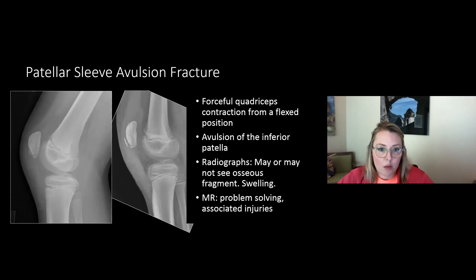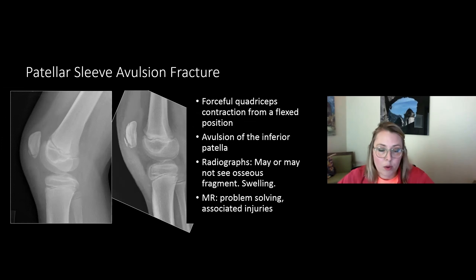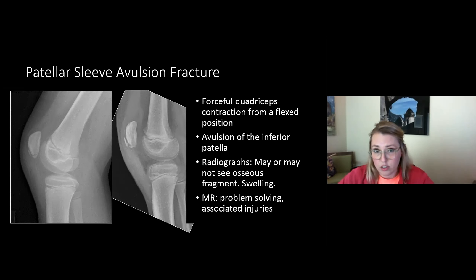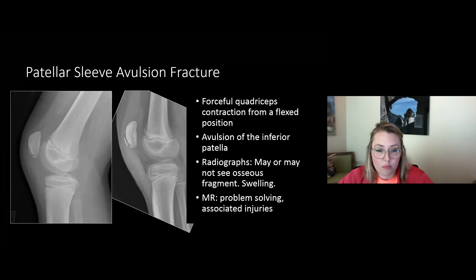At the other end of the patellar tendon, a patellar sleeve avulsion fracture results from forceful contraction avulsing cartilage from the inferior patella — often the avulsed portion is not yet ossified, making radiographs difficult. You may only see soft tissue swelling with the patella riding high. In other cases you can see actual fracture fragments displaced from the patella, thickening of the patellar tendon, and joint effusion. MRI can be used for problem solving and associated injuries but is often not clinically needed.